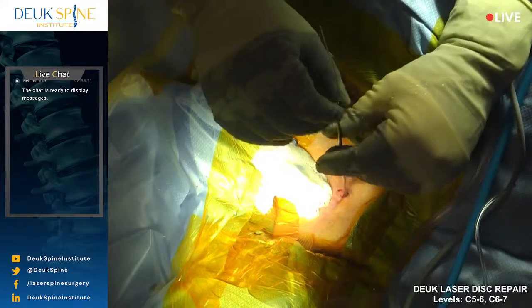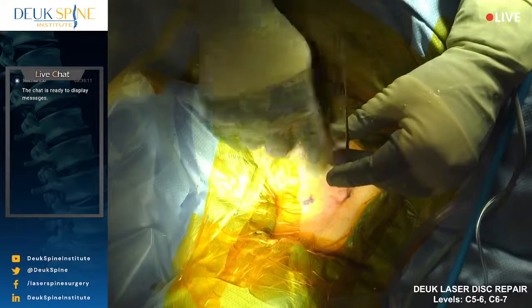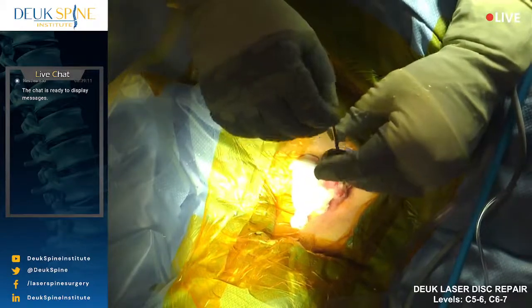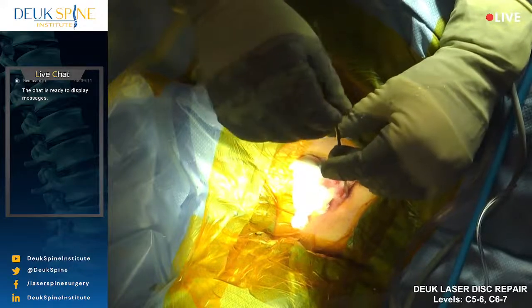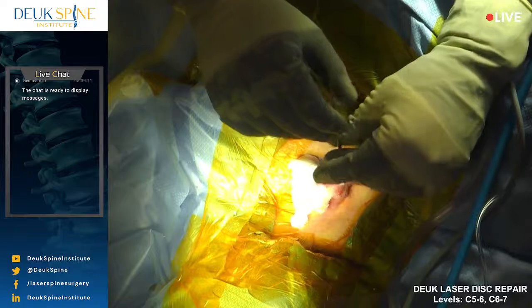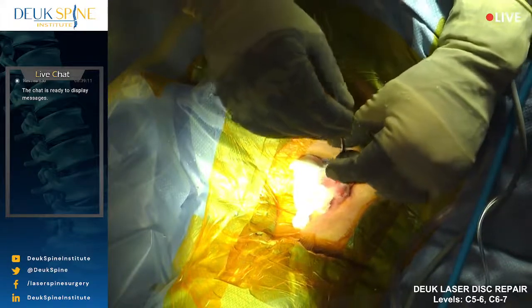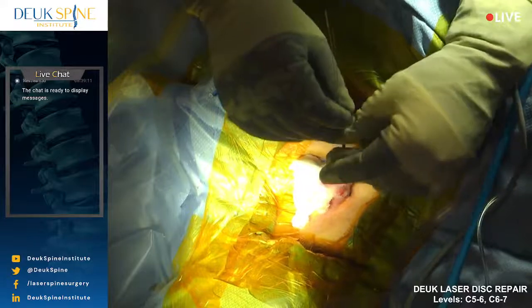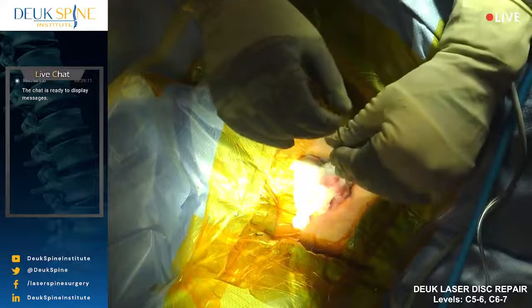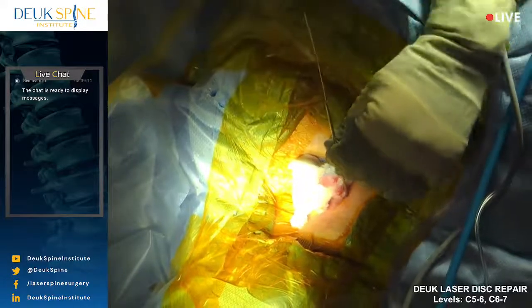And I'm using the dilator to spread tissues. The only bleeding we have is from me sticking the needle in to put the numbing medicine in the skin. Now I'm going to bring this dilator tip down to the front of the spine. And as I'm doing this, I'm twisting so that it doesn't grab the guide wire and drag it with it. All right, I'm going to need to get a lateral view in just a moment. I can actually feel the front of the spine. Okay, let's get a lateral view.